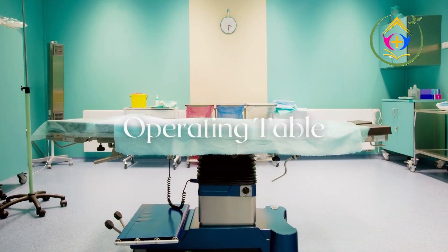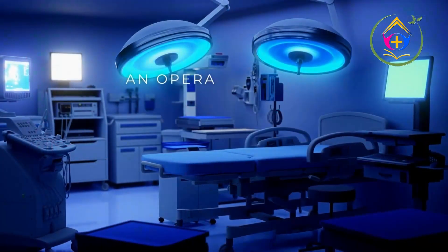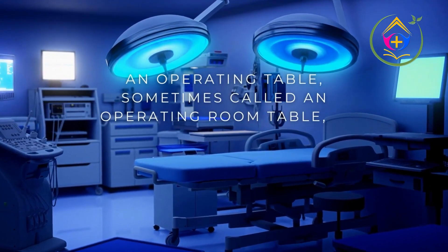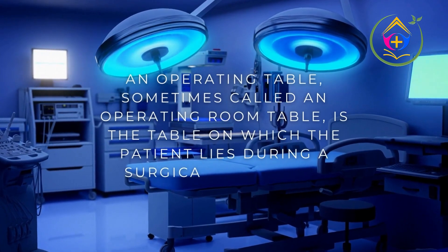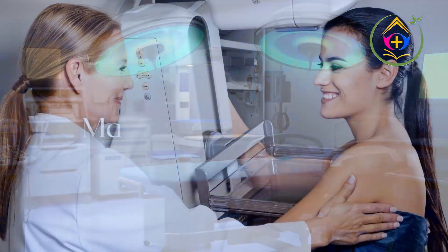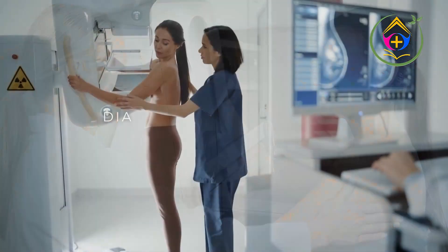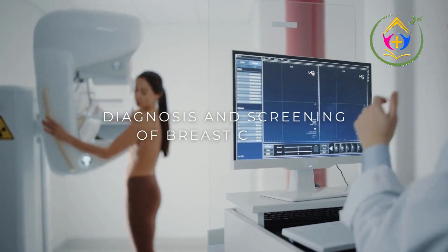Operating Table: sometimes called an operating room table, is the table on which the patient lies during a surgical operation. Mammogram Machine: used for diagnosis and screening of breast cancer.